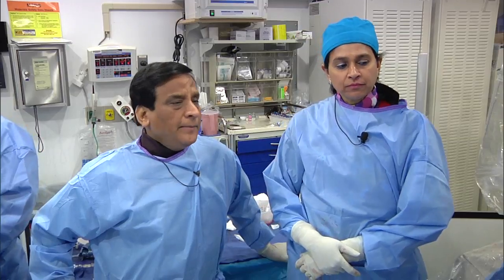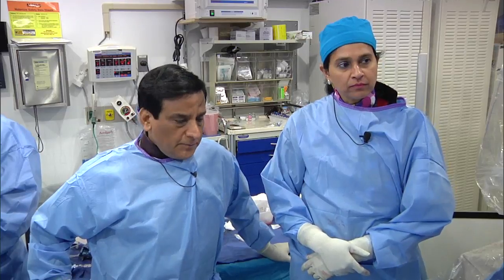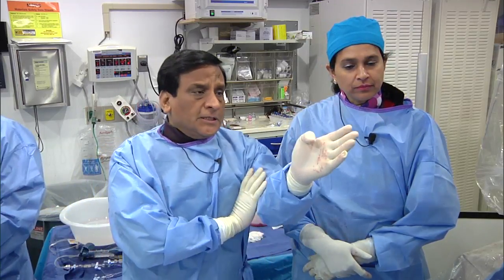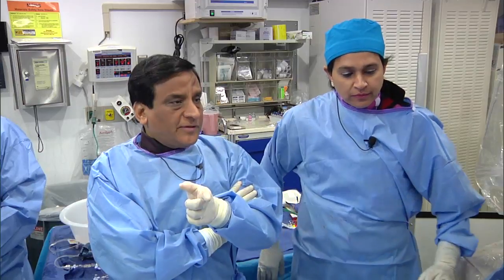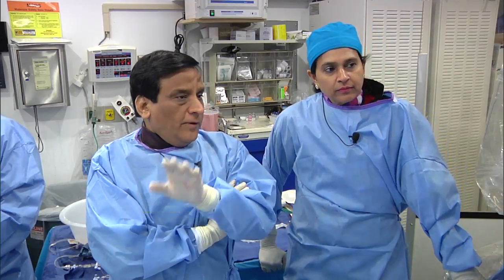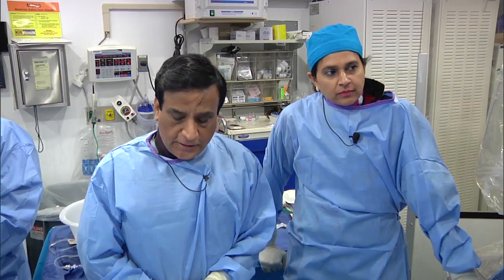What percentage would you give of any recurrence of disease in this lesion? Well, for this bifurcation, I would say anywhere between 5 to 10% in some area. Some might come back in the segment which we had left, or maybe the distal area in the OM2 after the bifurcation, because from the proximal circumflex going into the OM1 looks excellent. There is some chance of restenosis in this particular case in the OM2.